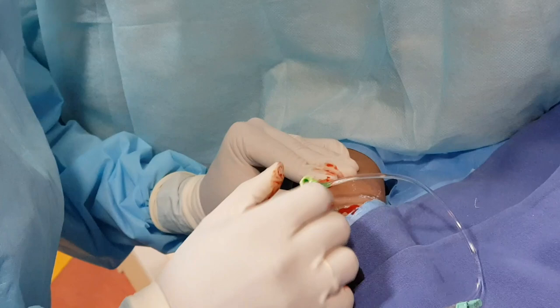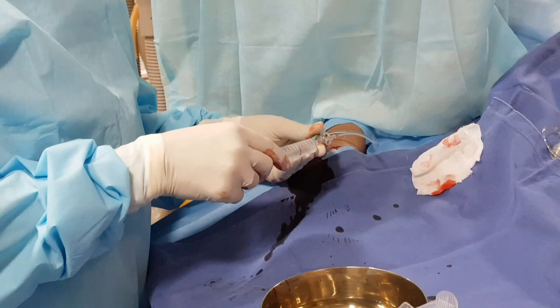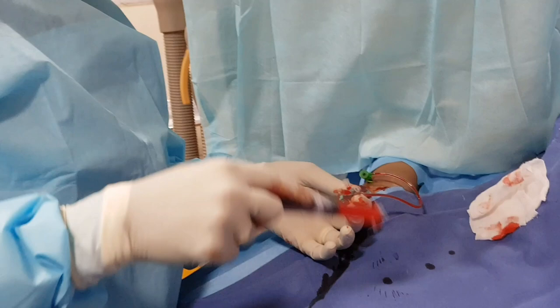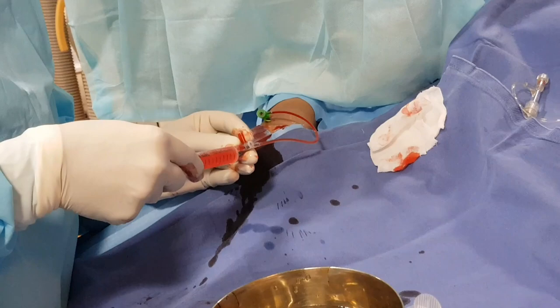Then what I do is I will remove the wire and dilator. Now I am going to give a cocktail which contains diltiazem, nitroglycerin, and heparin. Diltiazem and nitroglycerin are used to dilate the artery to make it larger. Heparin is to prevent blood clotting during the angioplasty. Usually we give 100 units per kilogram of heparin.